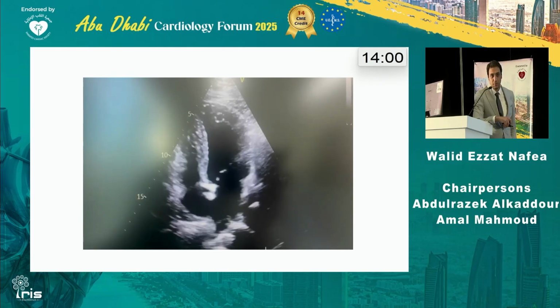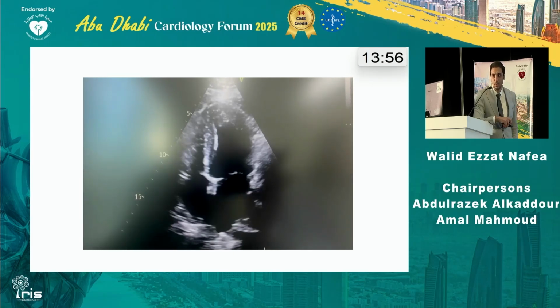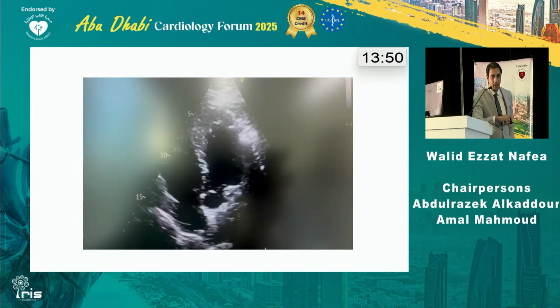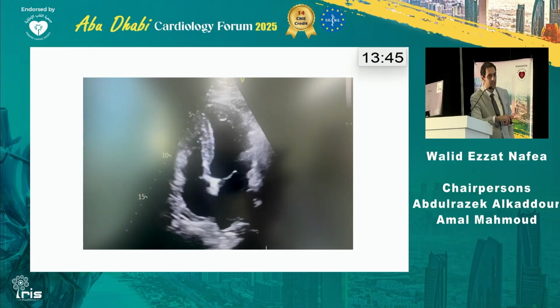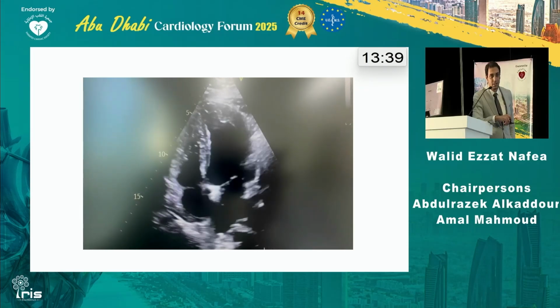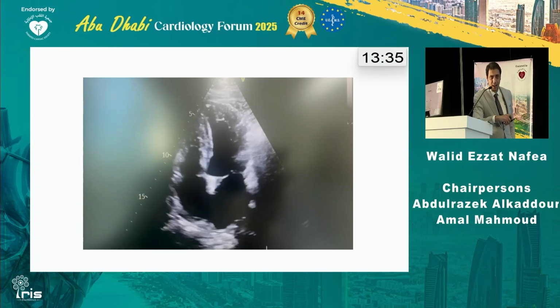What about the ejection fraction? Is it normal? Yeah, I believe it fairly touches the 50. It's not 55%. What about the apex? Do we find anything strange? Sort of non-compaction there. Forget about the title, maybe it's wrong. There are some recesses, but we are not sure at this time.